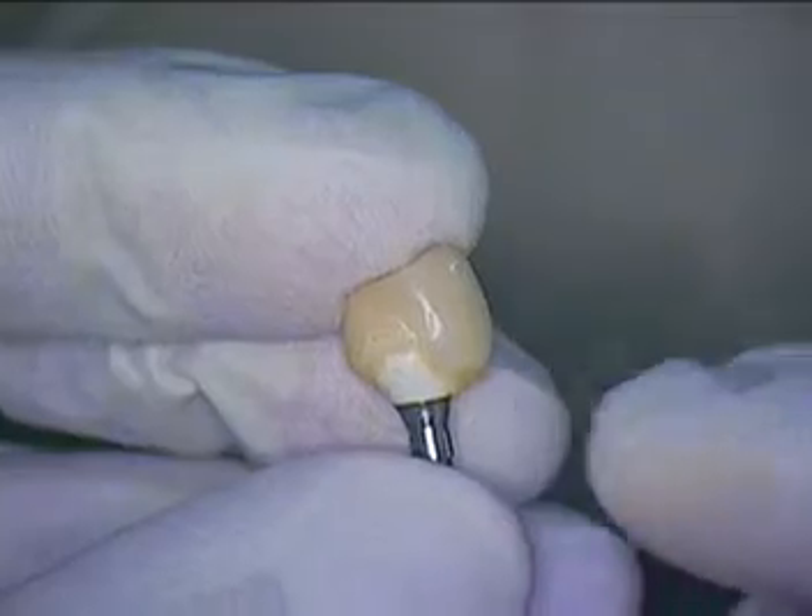Dr. Jerry Cuomo, we're back live on the third segment. We're getting ready to take our impression. I'm just going to show you a little bit about this overall dimension of this modified compression coping, comparing it with the somewhat over-contoured temporary that was made.